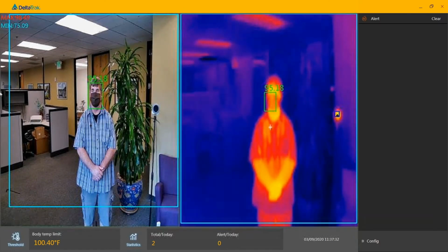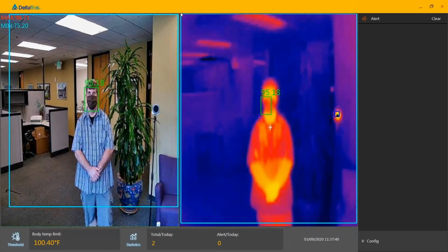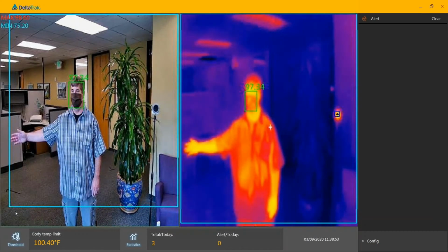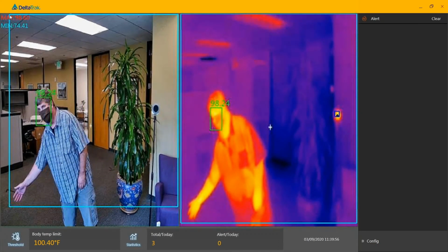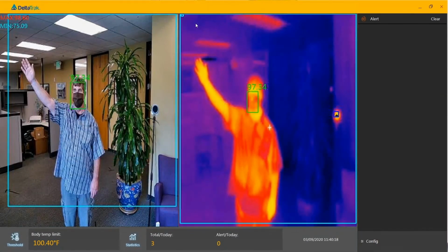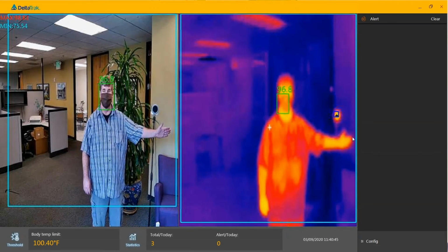Close the config screen to check or set the borders and edges to make sure the subjects being measured are in the camera's focal view. Note, we are still in the mode state while performing this operation. Have a test subject extend their arms to 6 different quadrant positions. This is done to verify or set the edges and boundaries to match between the camera and the thermal imaging view. Be careful not to cover the black body when performing this operation.